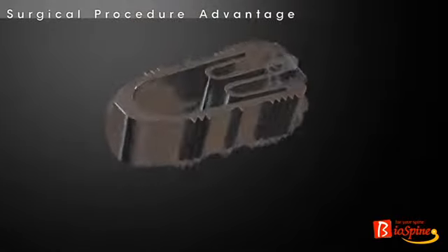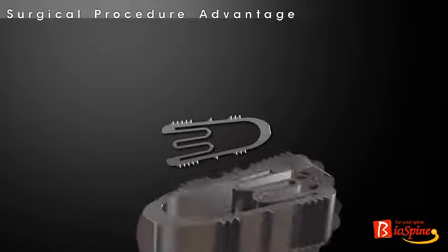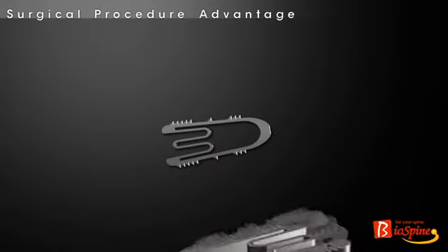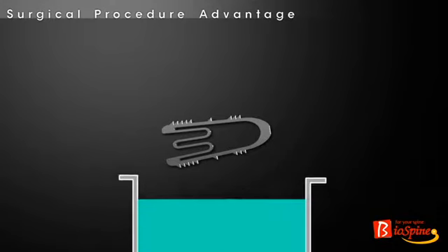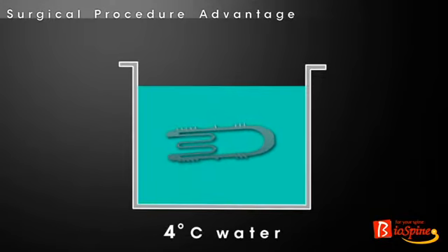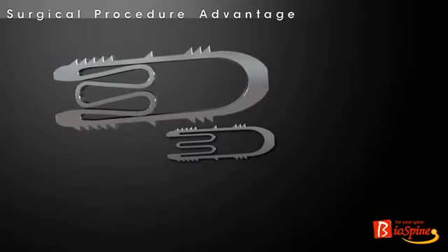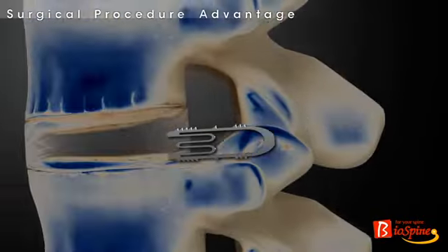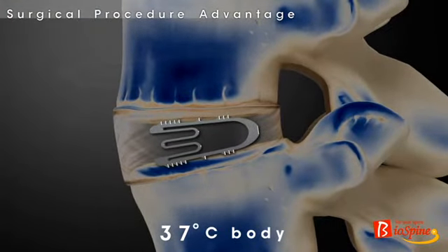Since the flexible cage system makes good use of self-setting by the shape memory effect of nitinol, it has a very strong advantage in surgical procedure. That is, since the flexible cage can be easily compressed in water at 4 degrees Celsius, the height of the cage becomes lowered. After it is inserted in the space between vertebral bodies, the flexible cage returns to the original shape at body temperature.